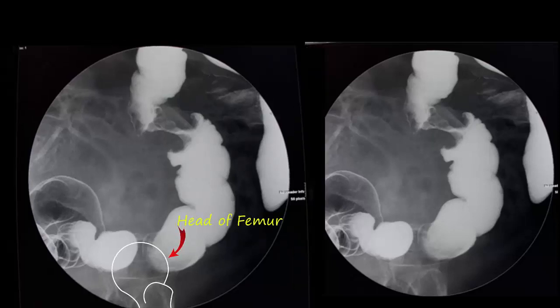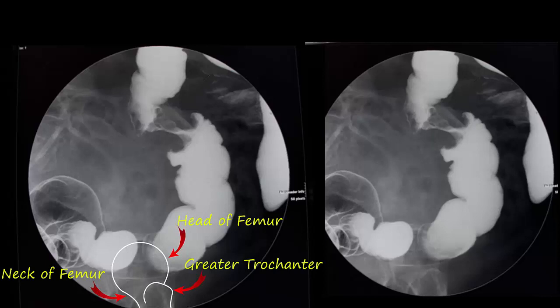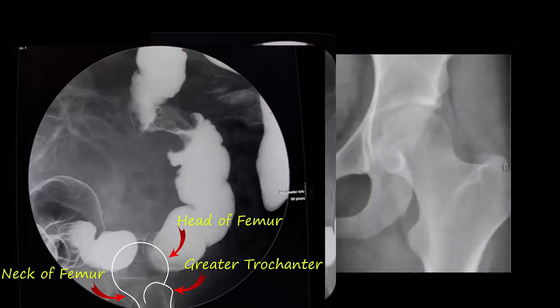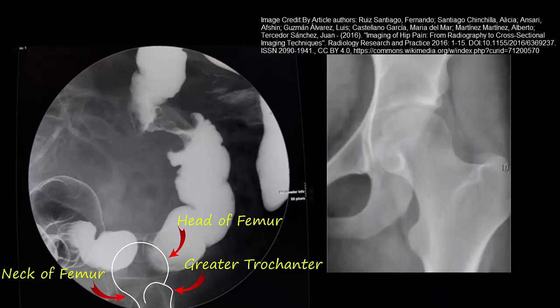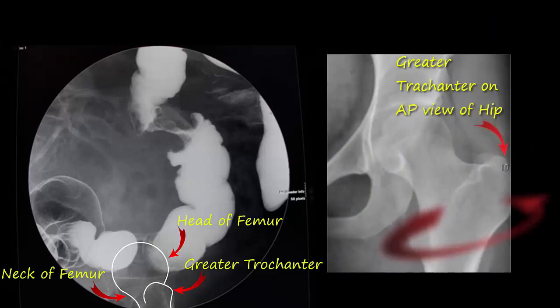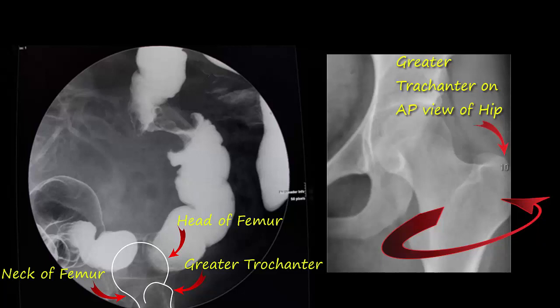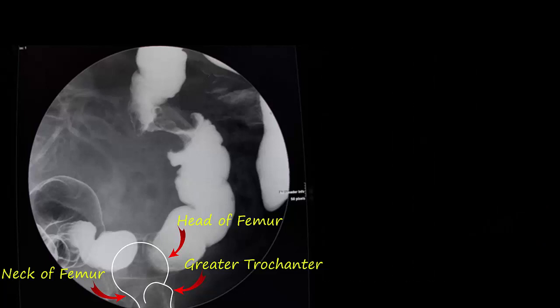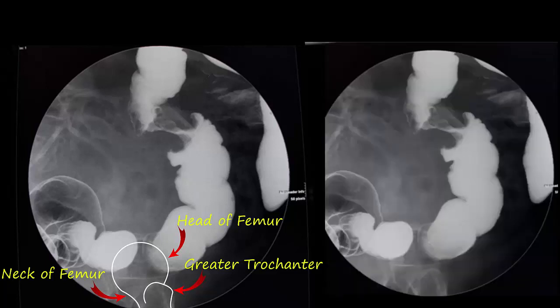You can see that one of the femoral heads is visible. This is the neck of the femur, and this is the greater trochanter. So we are definitely looking at one of the lower quadrants of the abdomen. Note that the neck of the femur is projecting over the greater trochanter. The greater trochanter is located laterally on an AP view of the hip joint. Only when you rotate the patient laterally does the greater trochanter go behind the neck, and the neck and greater trochanter appear superimposed on each other, as in this case. Thus we can conclude that the patient is rotated on the side, which is often necessary to take a clear view of the area of interest — in this case, the apple core lesion of the colon.